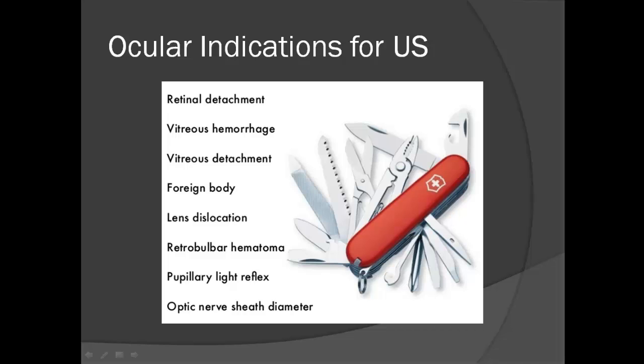If a patient comes in with trauma to their face, and you can't open their eye to be able to do a pupillary exam, you can actually use the ultrasound machine to visualize the pupil on the ultrasound screen and shine light into either an unaffected eye or even just on the outside of the unaffected eye in order to see a pupillary response of pupillary constriction. So that's a neat alternative that you can use to really evaluate for reflex of the pupil.